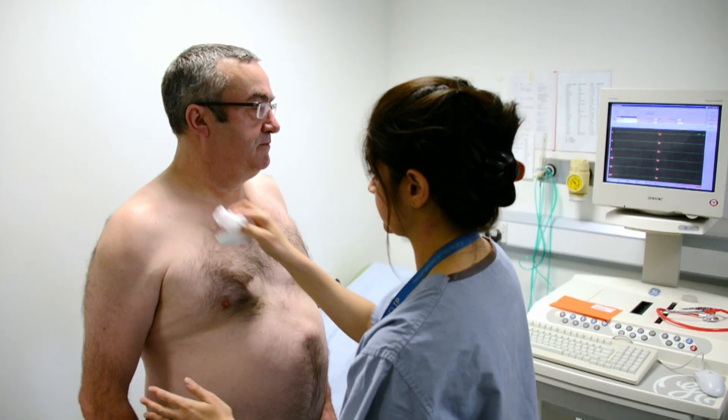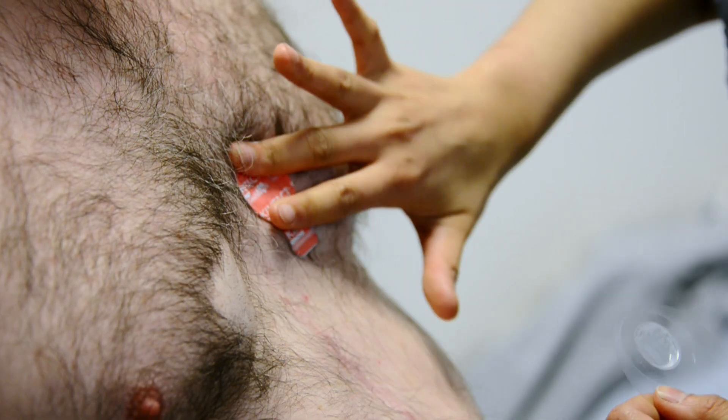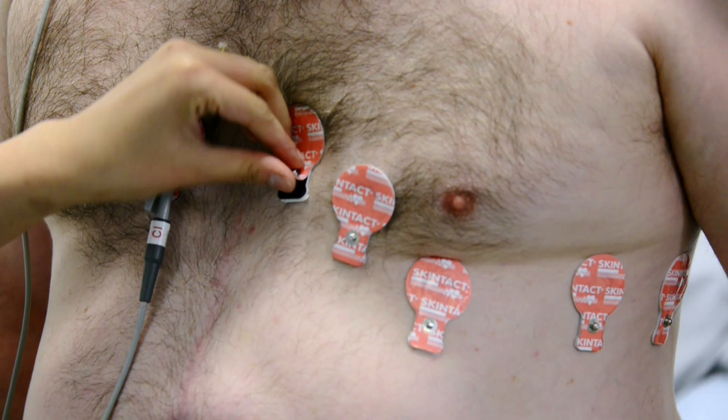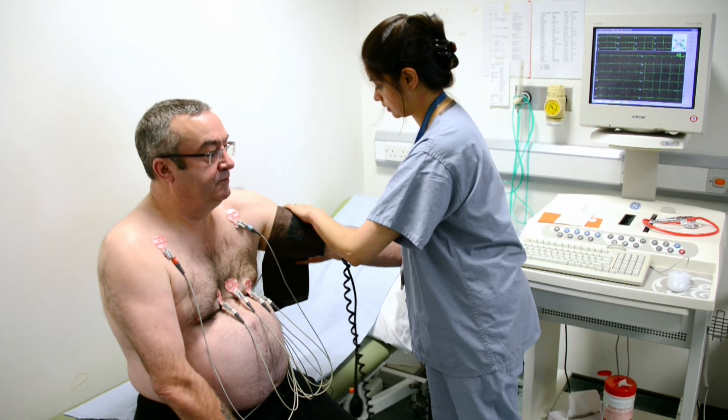We prepare the patient by asking them to remove their top clothes, and if you're female you'll be given a hospital gown. We'll put electrodes on the chest and they'll be hooked up to an ECG recording and a blood pressure cuff around their arm.